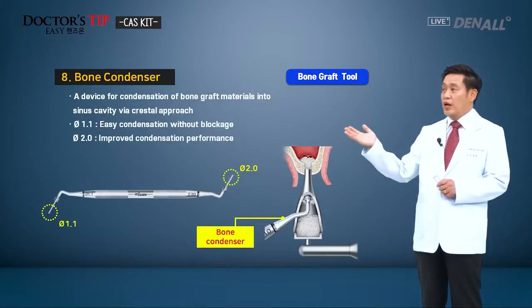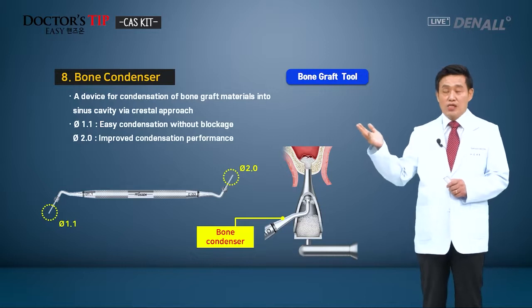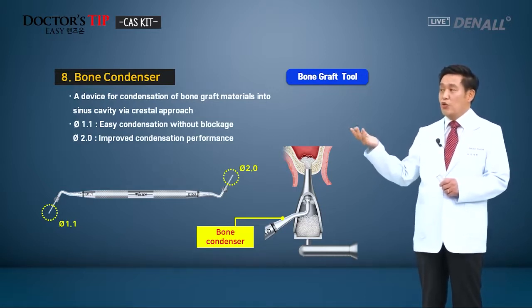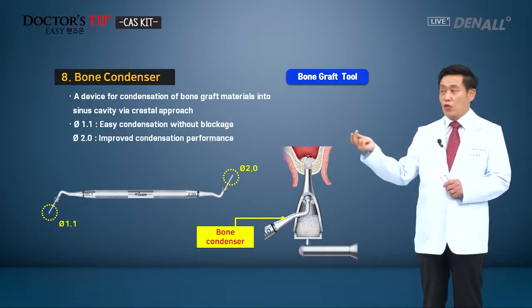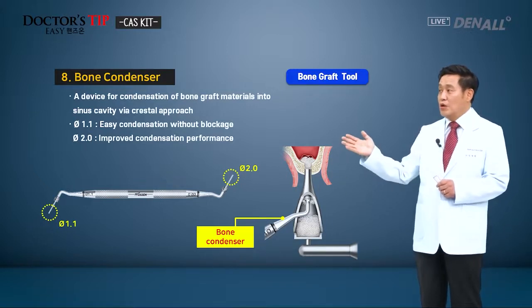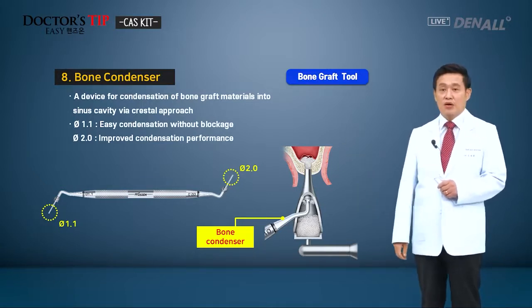Next, the bone condenser. Bone material is put into the bone carrier and hydrated. There are 2 diameters for the bone condenser, 1.1 and 2.0. 1.1 is used when bone graft material is blocked, to prevent that, to push it up continuously. Diameter 2.0 is used to lift up more bone material.